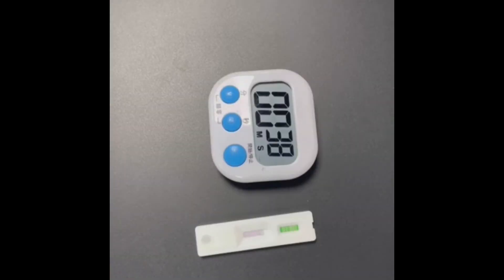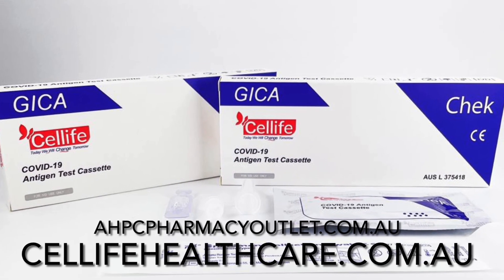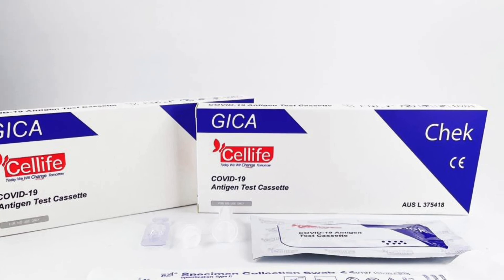Test results will appear within 15 minutes. Do not check after 20 minutes. One coloured line shows a negative result. For more information, visit cellifehealthcare.com.au.